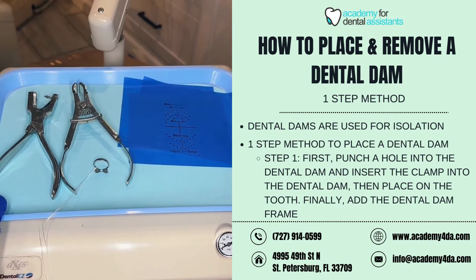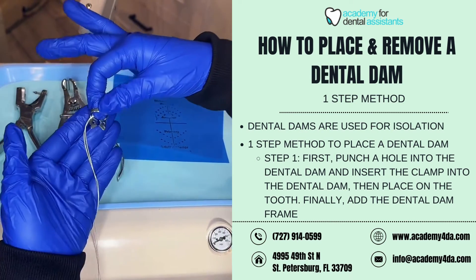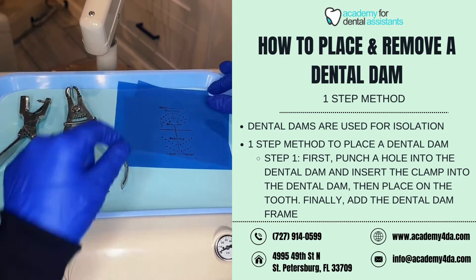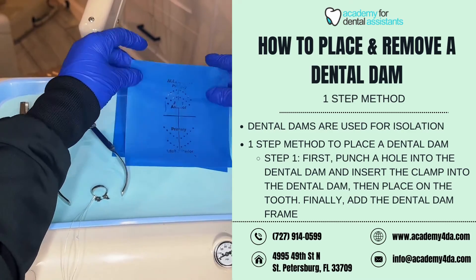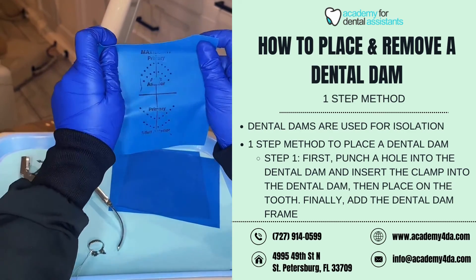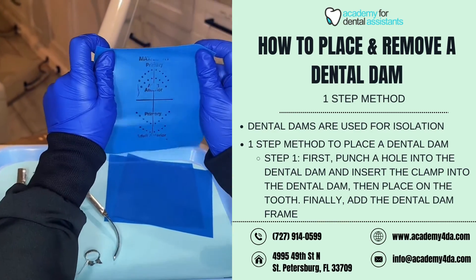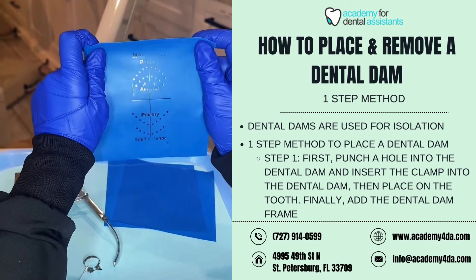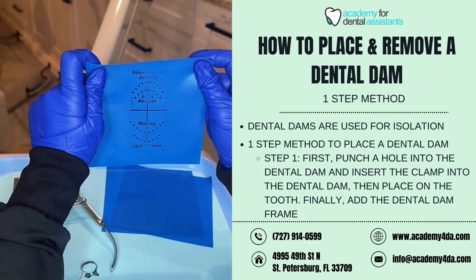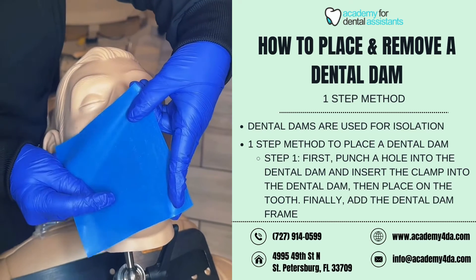With our one-step method, I'm going to demonstrate placing a dental dam on tooth number 28, which is a premolar. I have our premolar clamp set up and ready. I'm going to grab my dental dam — this one already has a stamp for training purposes so you can see the layout of the mouth, since when you punch your hole you want it to be in the area of the tooth you're working on.